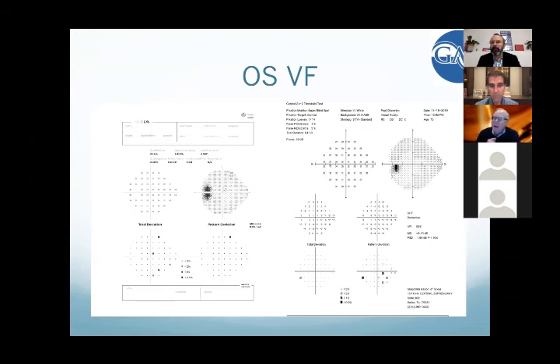it will go back and present a much brighter light, 10 times brighter at 20 decibels. And if they don't see that, that's a false negative. Am I correct on that, Alberto? That is correct. The only thing that we're doing a little bit differently is that when we looked into the reliability of visual field, we found very strong evidence that false negative doesn't affect the reliability of the visual field like the false positive.